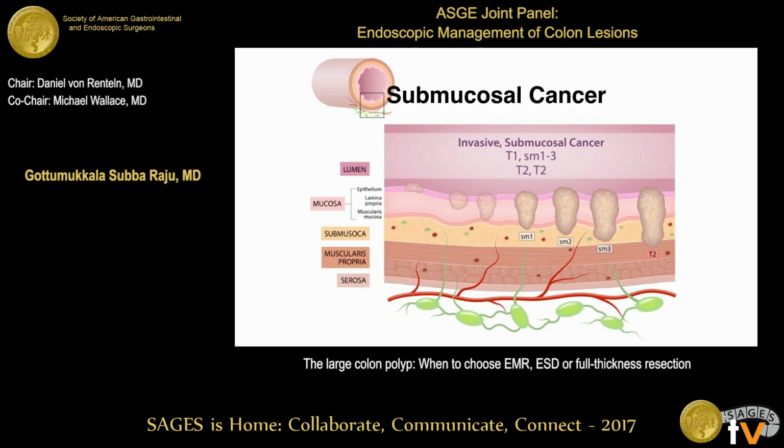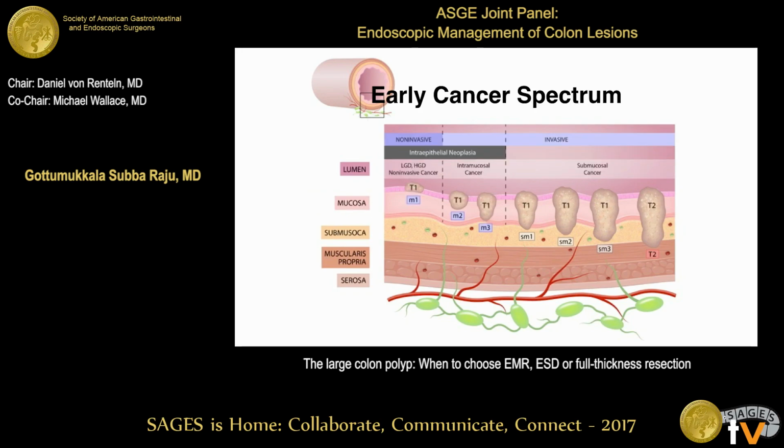And the lesions that go into the muscle are beyond the scope of an endoscopist. They need to be managed by surgeons. So this is the most important slide to understand the concepts about which ones you do EMR and which ones you do ESD and which ones you send for surgery. And I'm going to come back to this slide in my conclusion slide to give you a take-home message.